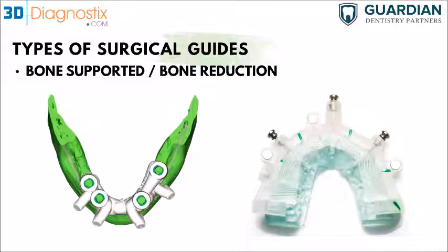And we've designed it in a way to avoid having any flange on lingual or palatal surfaces, because it's a lot easier not to reflect the tissue, especially in the maxilla, where you've got thick keratinized tissue. So this would make it easier to have the guide seated without extending the flap too much. And once you've seated the guide, you use this platform right here to level the bone to be parallel to this, or just at the same level of this platform.